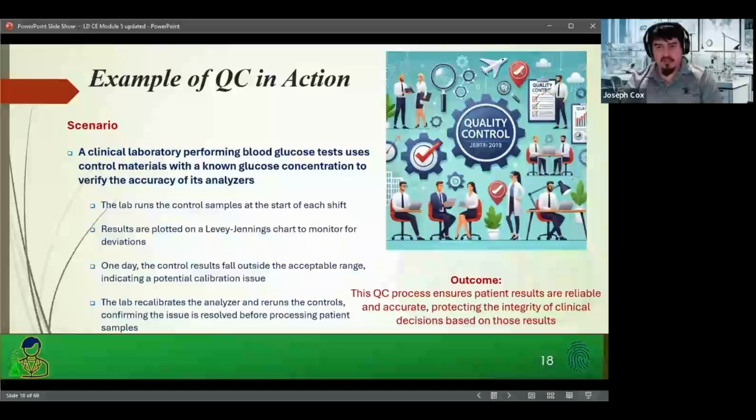By testing the QC at the beginning of the shift, without testing any patient samples, there's no impact. If there is an issue, maybe for some reason glucose can't pass, maybe you're out of calibration standard, maybe the QC lot you have isn't working, maybe it expired, maybe it was left out overnight and now it fails and you don't have another one in the container, you can't test patients that day. So it's important to have redundancy. I love to have redundancy. It's important to have backups. Don't be cheap when it comes to QC materials, calibration materials, and reagents, because it helps with troubleshooting. If you have things on hand, it's going to help you out a lot. But I digress.